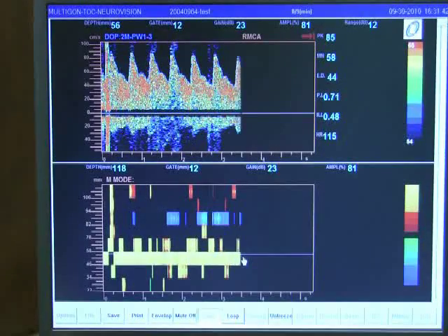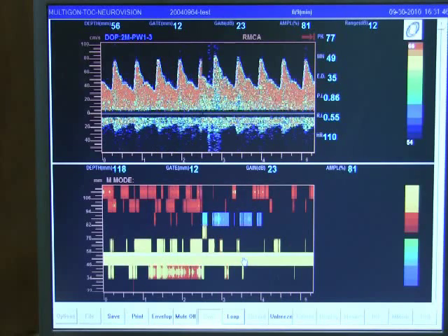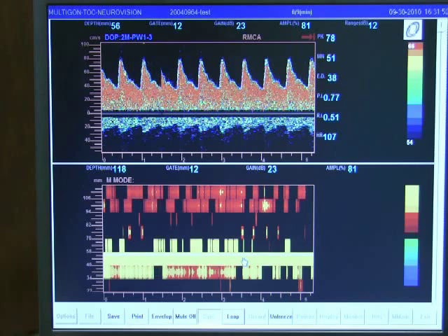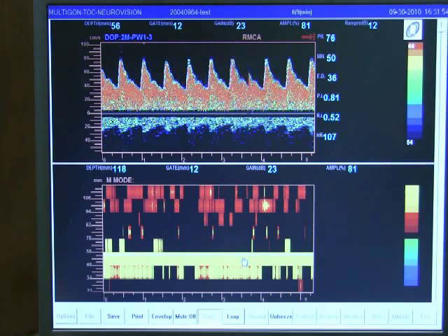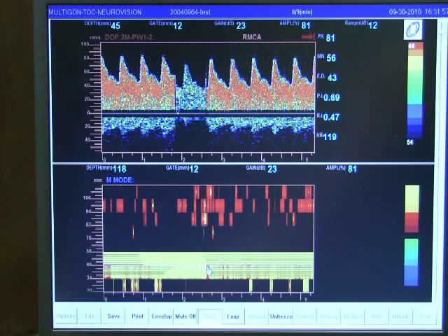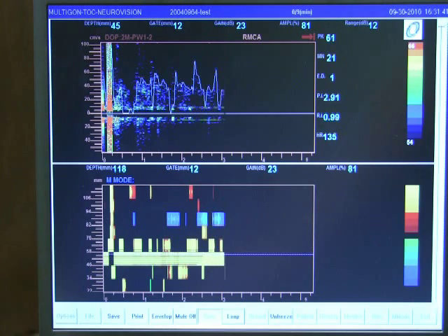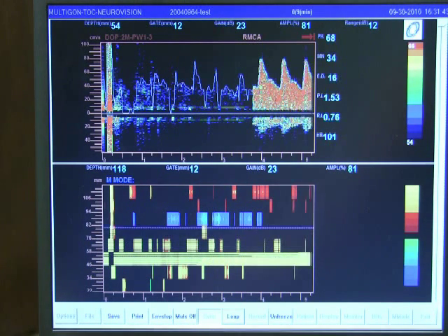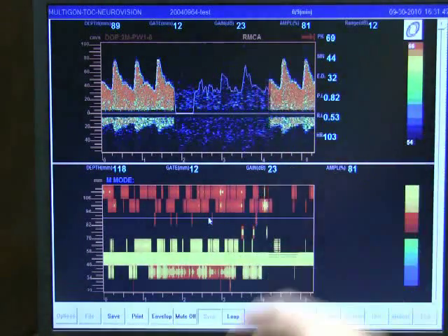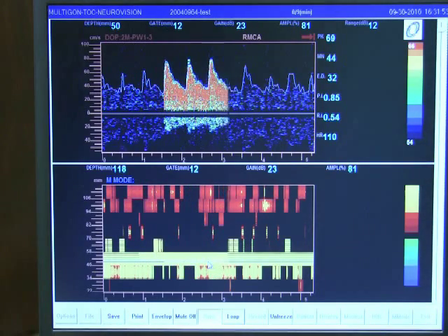Insonating with M mode is the same concept. M mode is relatively new to transcranial Doppler. Its evolution in time lets you see multiple depths simultaneously represented in solid bars. You can change to the depth and go see what's at that particular depth where the bar is being shown. And you can move it around by changing the midline. This is a depth at 89 and you're seeing the contralateral MCA and ACA, and we can revert back to the previous depth.